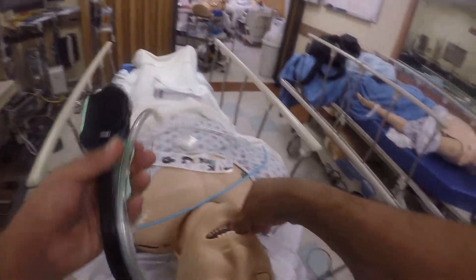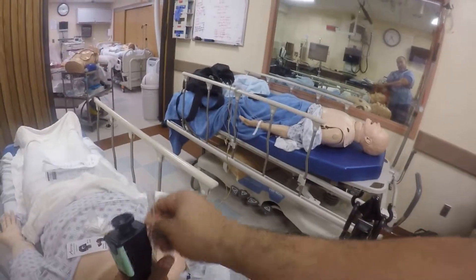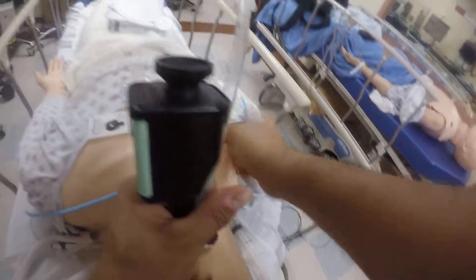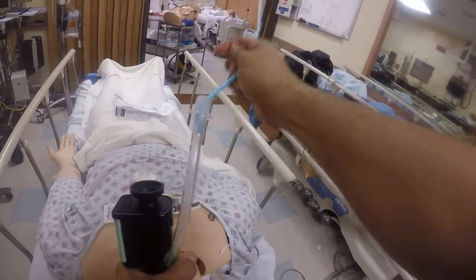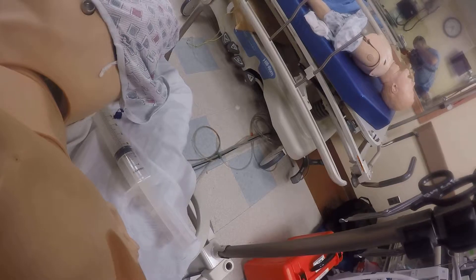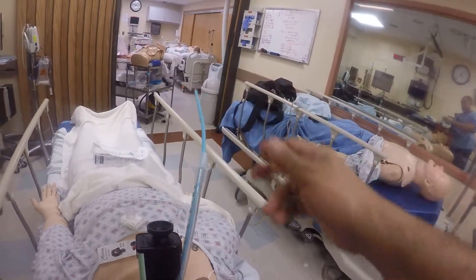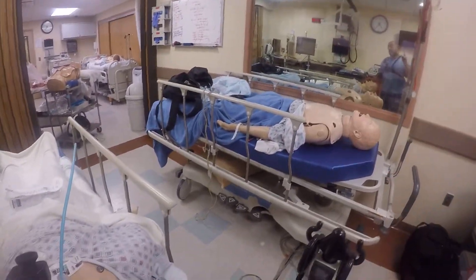I tried to intubate, I would see a bad airway, try to push the tube in — some difficulties. So what would I do? Guide my bougie, coude tip down, and try to pass it. Go as far as you can to the carina, then try to railroad my ET tube past, overcoming the edema, the obstruction, perhaps even epiglottitis.